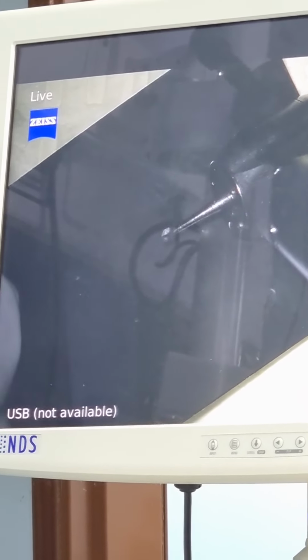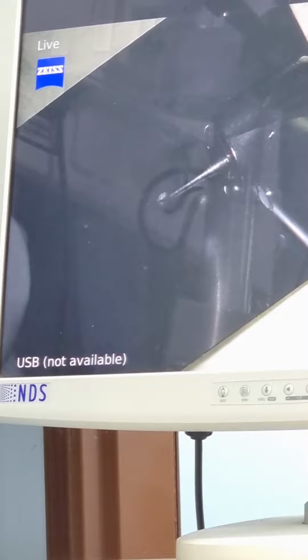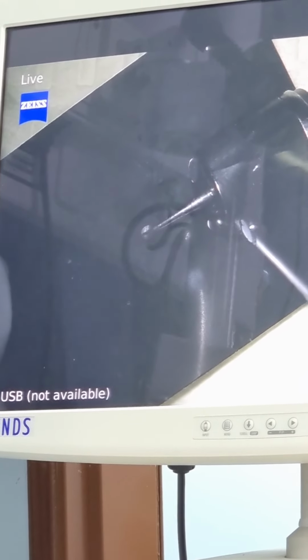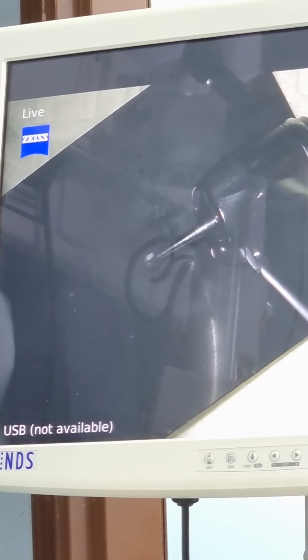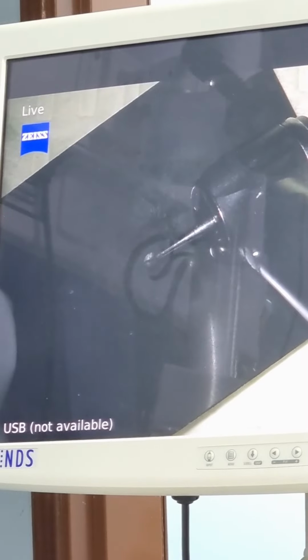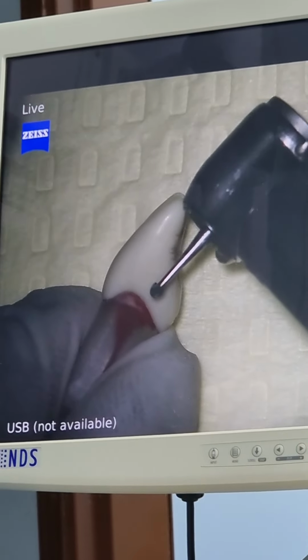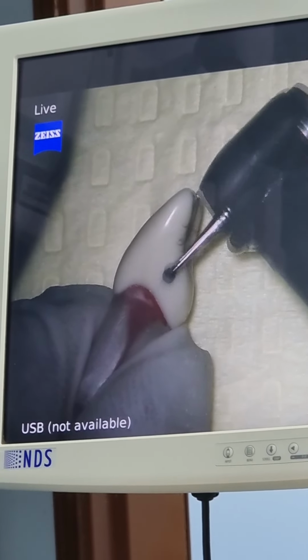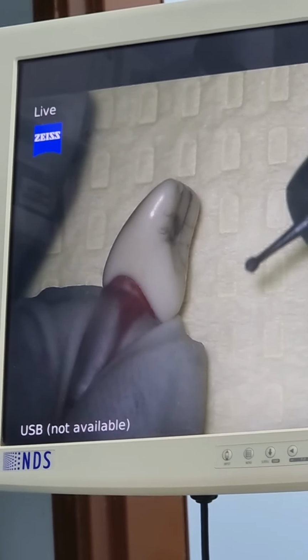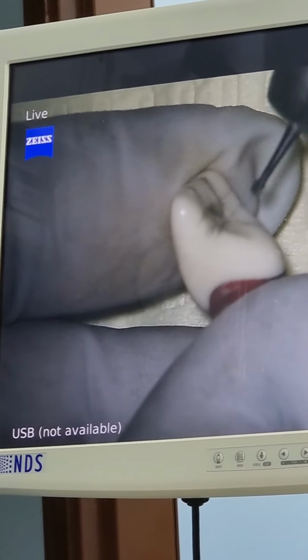The distance from where to where? From the incisal edge till the pulp chamber roof. And that distance, either you imagine it on the shank, or you draw a mark on the shank of the round bur with a marker or something, it's up to you. This is a reference for how deep you have to go inside the tooth to gain entry to expose the pulp chamber. As I told you, it can be anywhere from 4 to 6 millimeters. So once you have this, you start with the preparation.